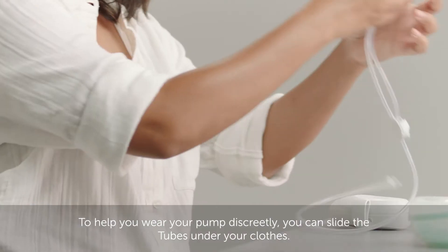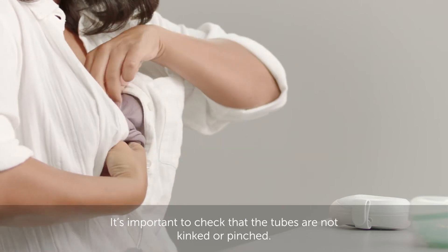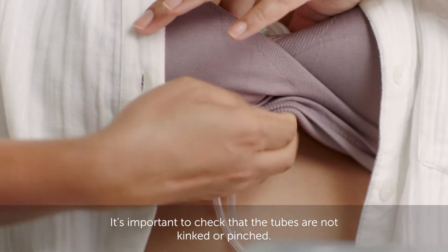To help you wear your pump discreetly, you can slide the tubes under your clothes. It's important to check that the tubes are not kinked or pinched.